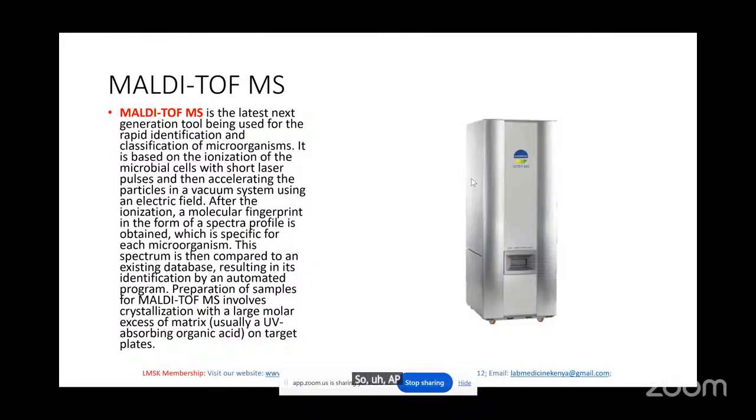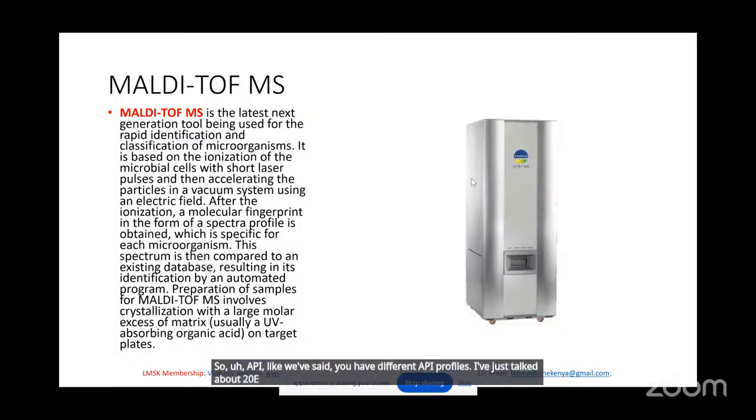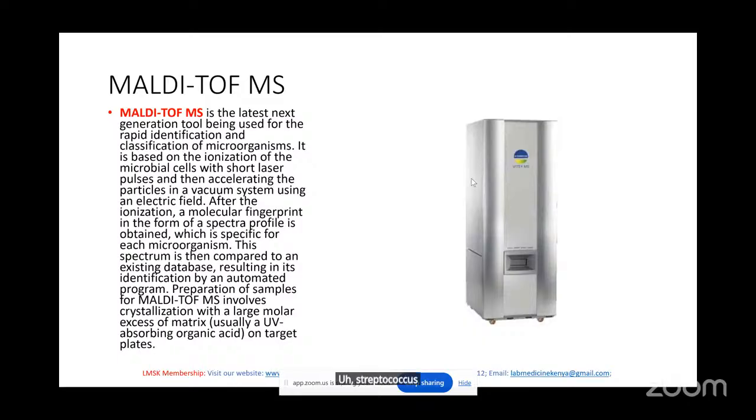So API, like we've said, you have different API profiles. I've just talked about 20E. You'll have API for Staphylococcus, for Streptococcus. You'll have for non-Enterobacterales. So you'll have different profiles.